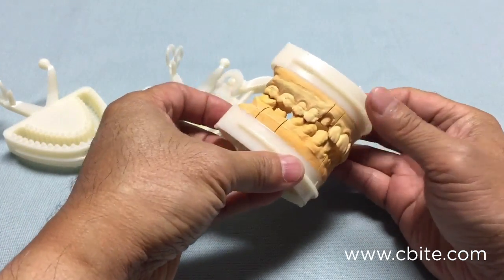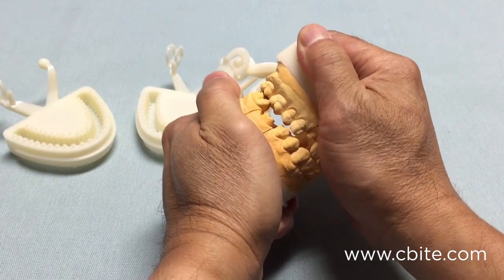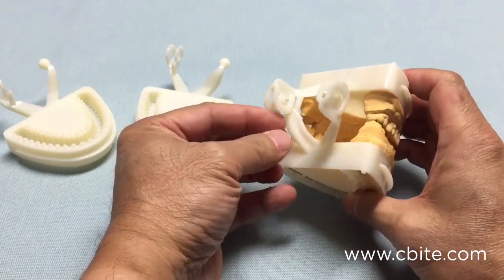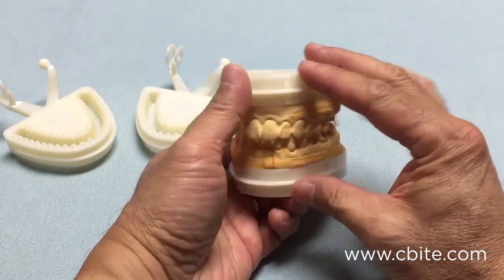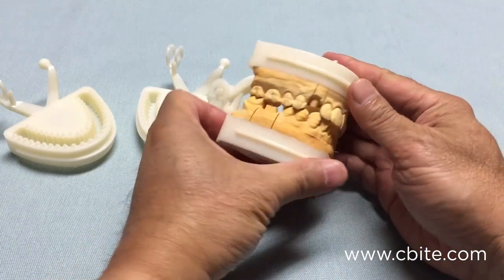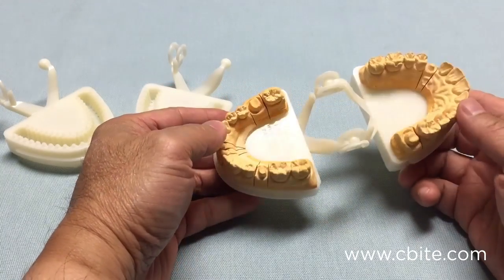You also have nice lateral and protrusive movement. The ball and clasp design of the Seabite articulators does a good job of simulating the condyle. This is also ideal for doing implant restorations.